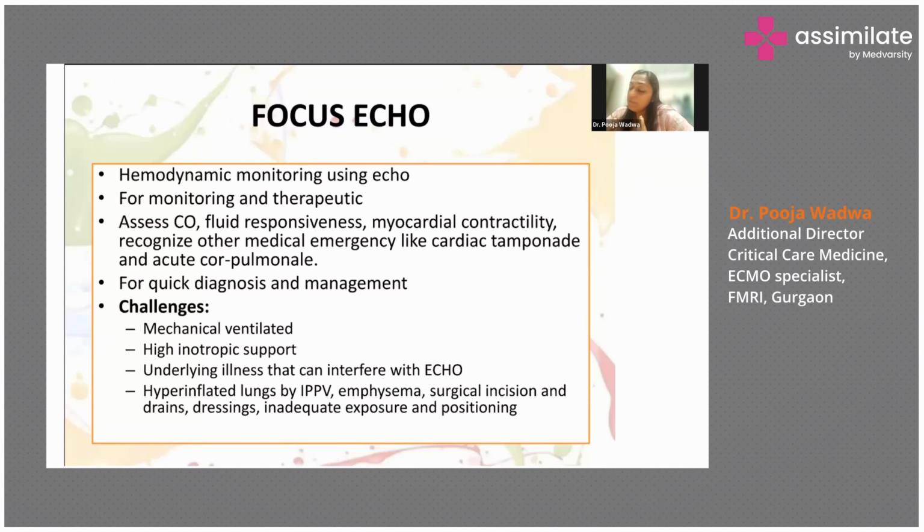Now it could be purely for monitoring, or it can be used as a therapeutic tool also, for removing some fluid or inserting drains. So what does echo help us with? It helps us in assessing the cardiac output and the fluid responsiveness. Like you give some fluid and want to see whether your patient is responding or not. Before assessing it clinically, you can look at the echo and see directly his cardiac chambers, his contractility, his IVC, and assess whether your patient is fluid responsive or not.